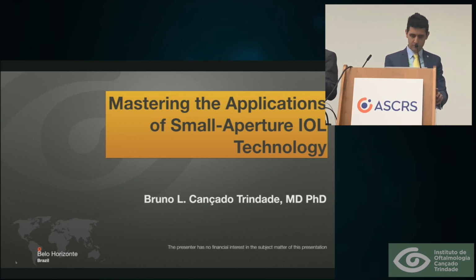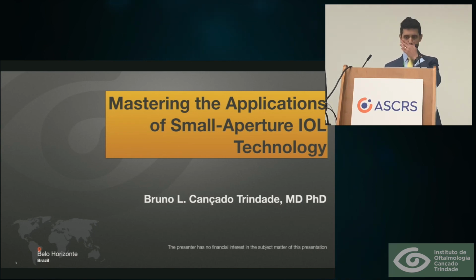One great benefit of the IC8 is that you can examine the retina easier because of the outer transparent area. And the sulcus piggyback implant has the benefit of being able to use it primarily or secondarily. Sometimes we have surprisingly good results with conventional cataract surgery in cases of irregular astigmatism. So it might be better to go just with regular cataract surgery and then, if necessary, do the pinhole implantation.